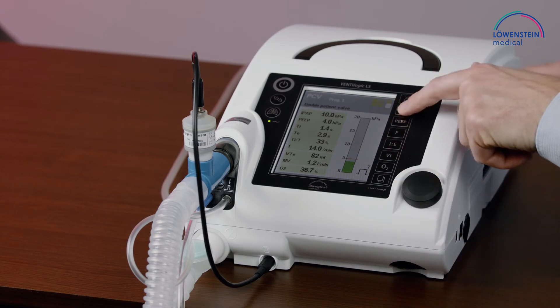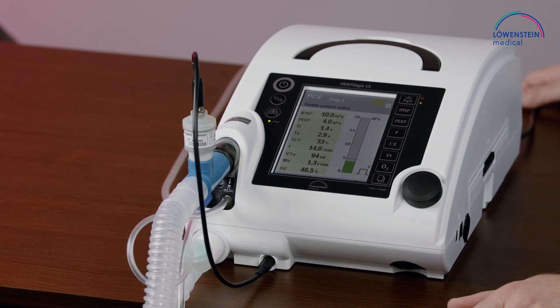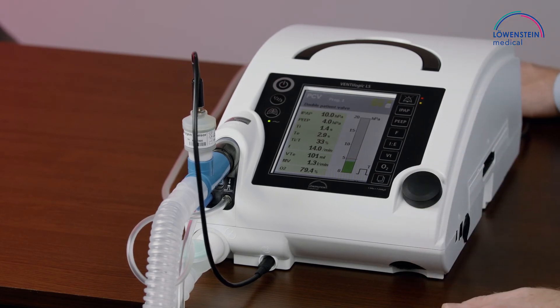While in this setting we will reach quite high — up to 100%, 99.9% FiO2 — because the oxygen concentration is highly dependent on the I:E ratio, frequency, and pressure levels. There is a certain amount of oxygen fed into the device, and the higher the volume, the lower the FiO2 concentration.